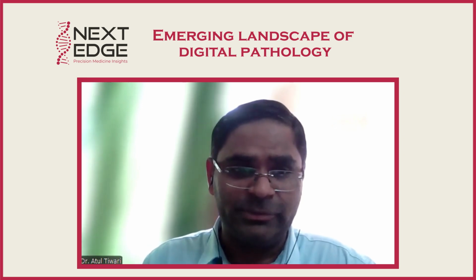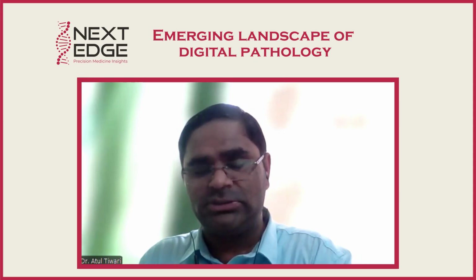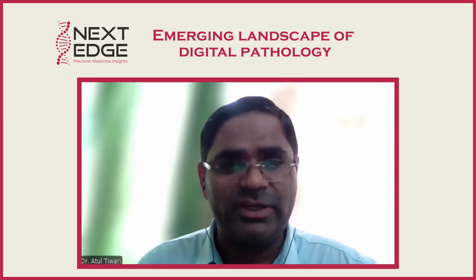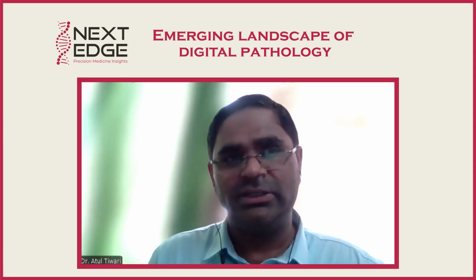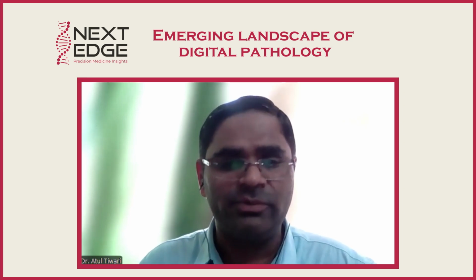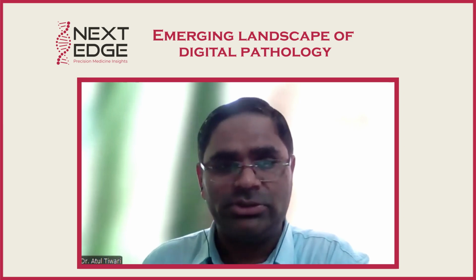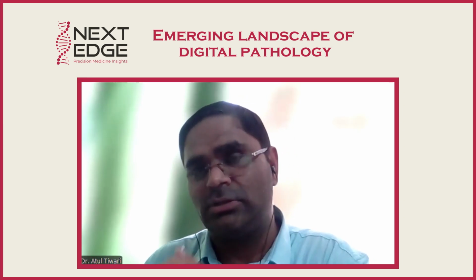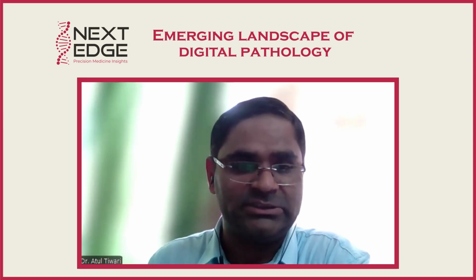Then consistency. There might be a dispute between two pathologists. Inter-observer variation is very common whenever we look at an image, especially on the glass slide. Inter-observer variation is part and parcel of our life. So if we have an AI model or digital pathology, it will help us get an accurate enough diagnosis, and it will help us maintain consistency.